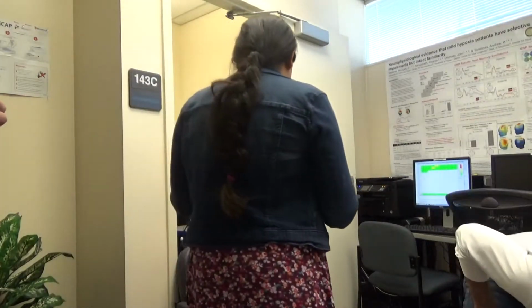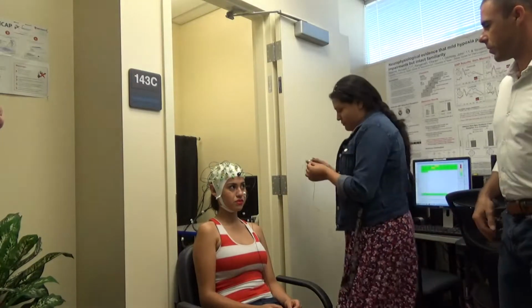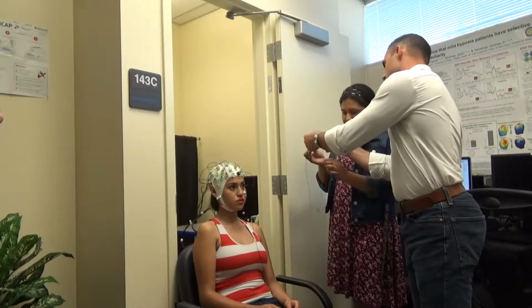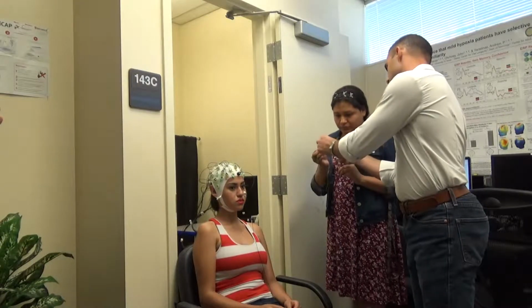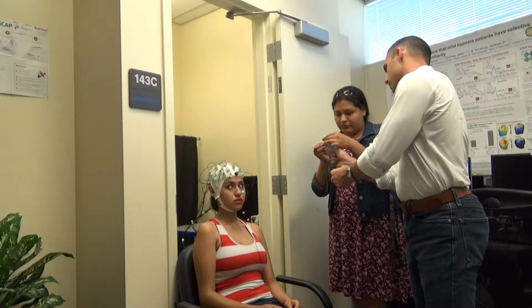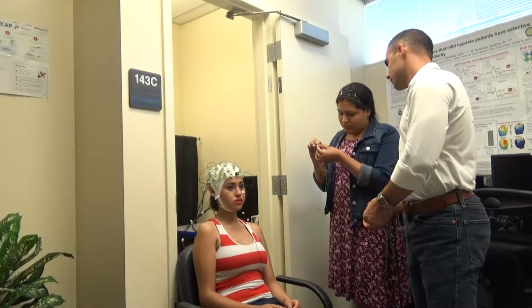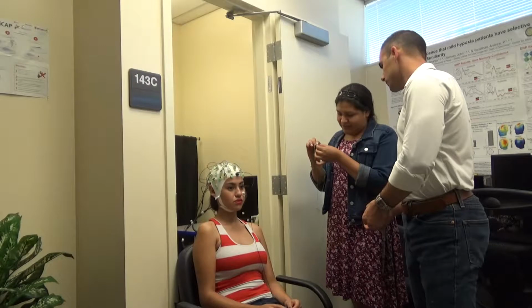This one's gonna be on the side. Okay, so is that gonna be the upper one or the horizontal? Horizontal? Yes. Okay, so that means we're probably gonna want it this way, which means we want to put, again, the tab part down. It's thicker, so it doesn't matter. Look at the first section. Pull it off on the bottom. Put it on. It's kind of on your face. Right? That's right.